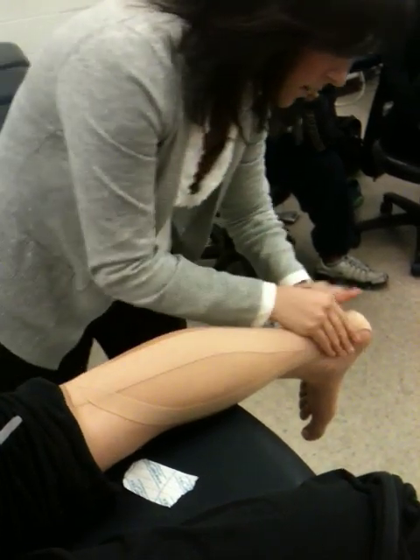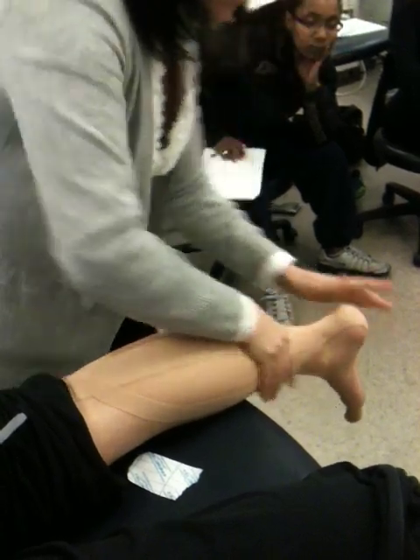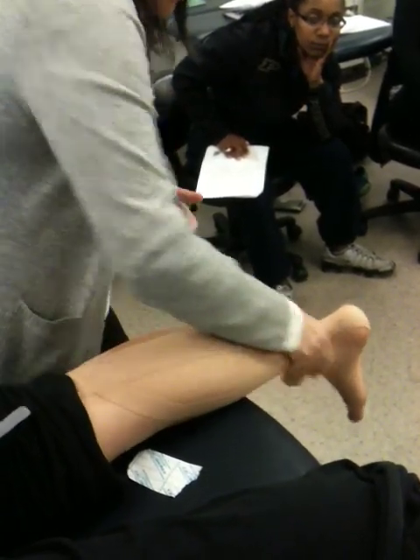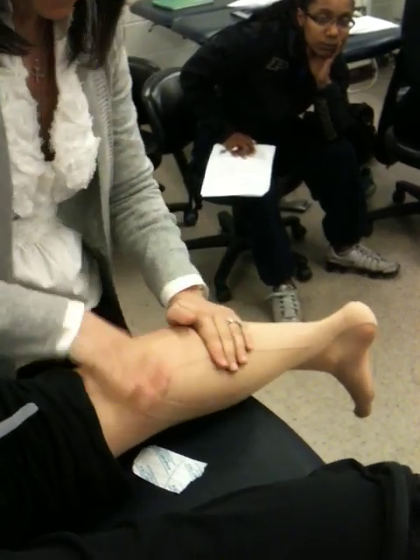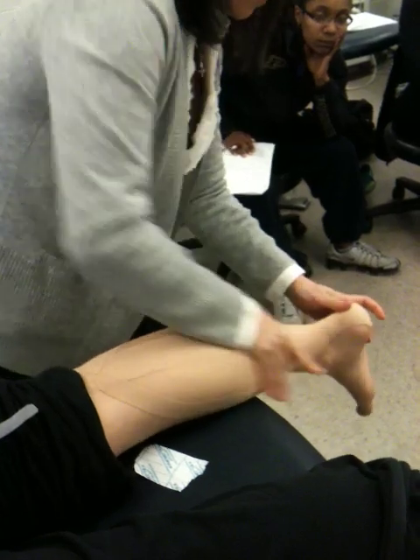Relax your foot. Last but not least, you're going to activate the glue when you're dealing with kinesio — heat it up, give it a good rub without peeling off the edges, and then she's ready to go.